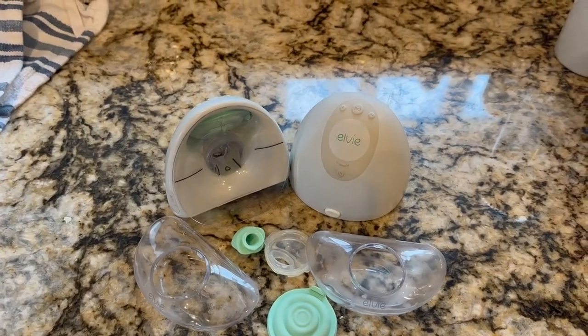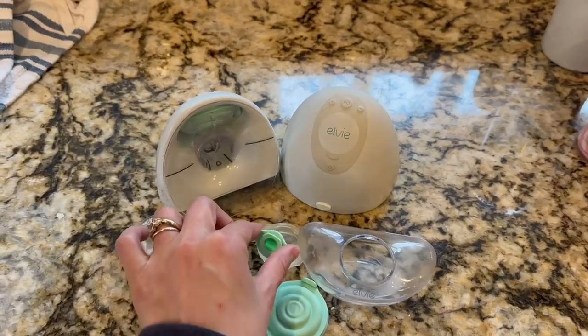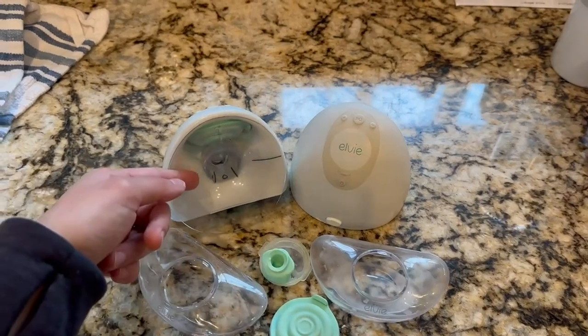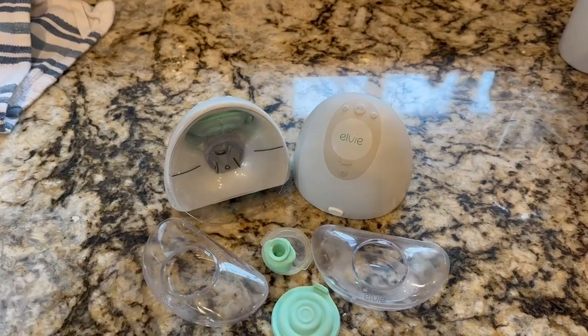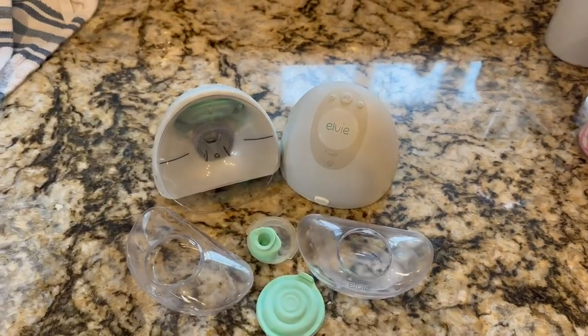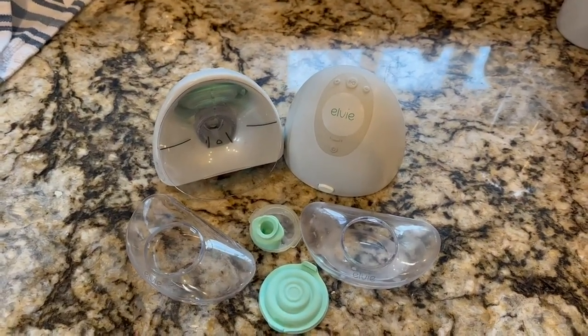The ease of using the breast pump well outweighs what I feel are some of the disadvantages, such as these little pieces here that clip on to the caps that go on the pieces that go into your breast pump to be worn. Those have worn out twice — I've had to go buy replacements for those.